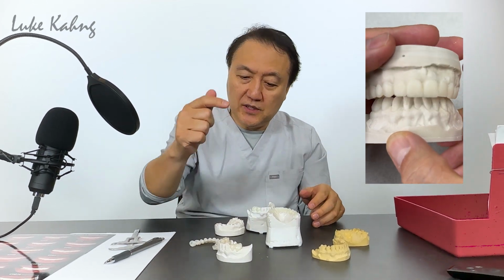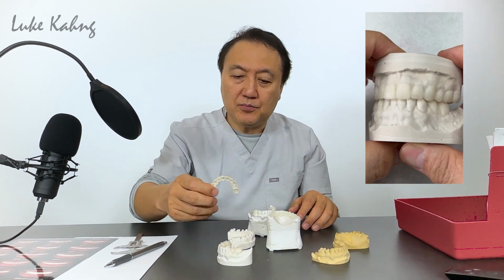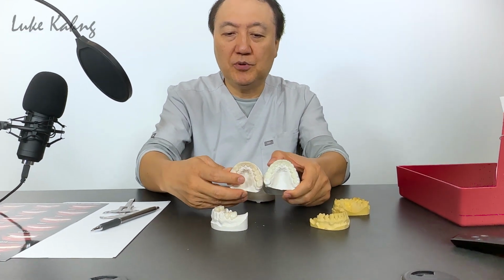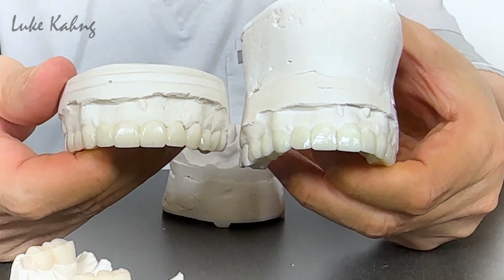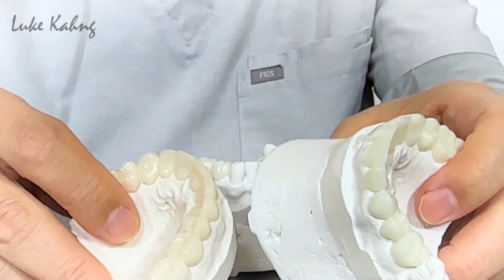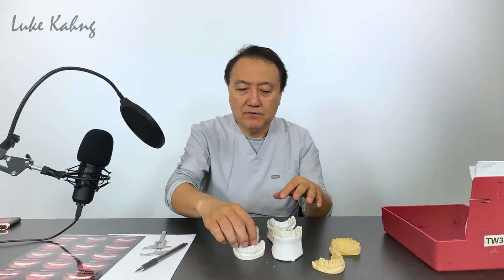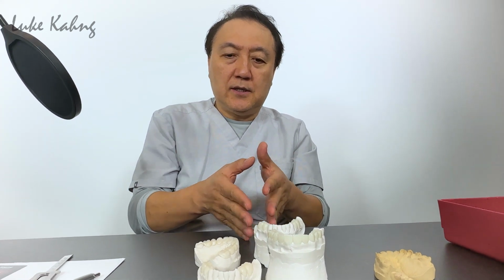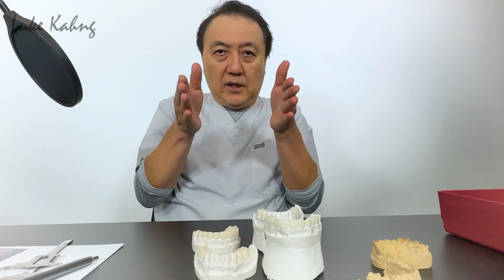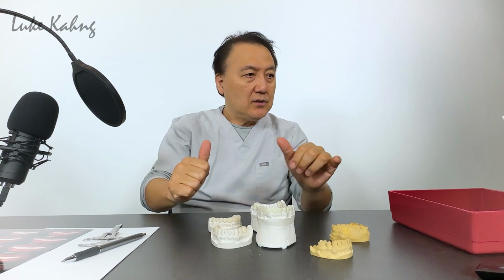And not only that, I have to duplicate it, so we make another duplicate model from the prep. So I have to prep it, and then we fabricate it exactly duplicated from the wax-up and the final temporizations. Okay, then we can deliver two sets to the doctors. So when the doctors have it in their hand, they know what I did here, and then they can follow. I mean, they can grind here and there. It's not a problem. So after they put in the temporizations, I look at it.